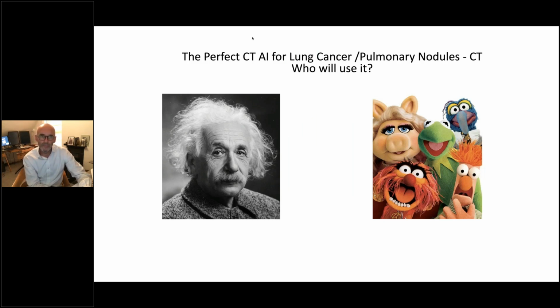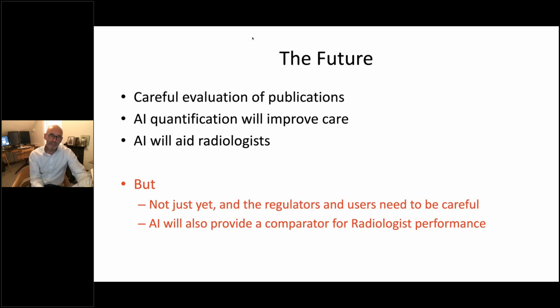So I think in the future, this really does apply to the regulators and those purchasing the algorithms. Everyone's got to really carefully evaluate them. I know NICE has just put a call out for expertise to evaluate chest X-ray AI algorithms. So we've got to be careful when we review that literature.